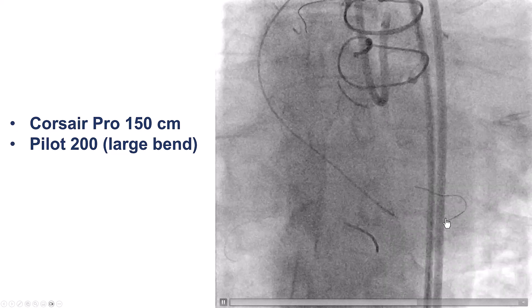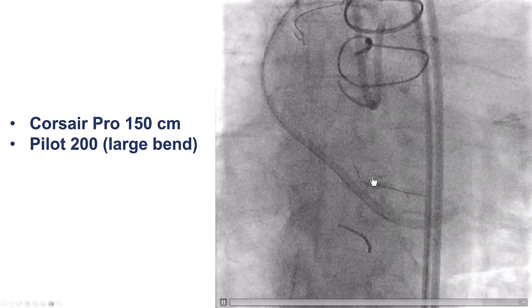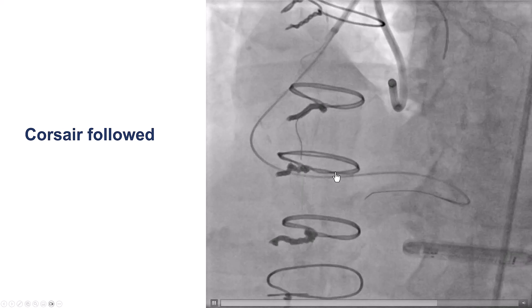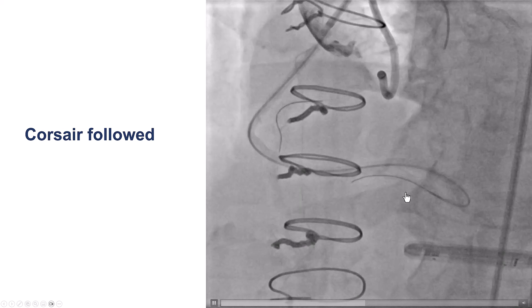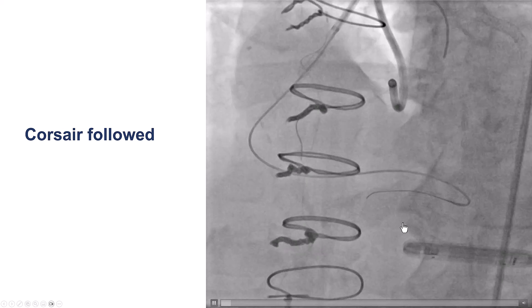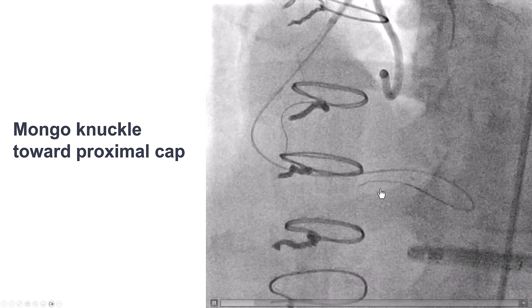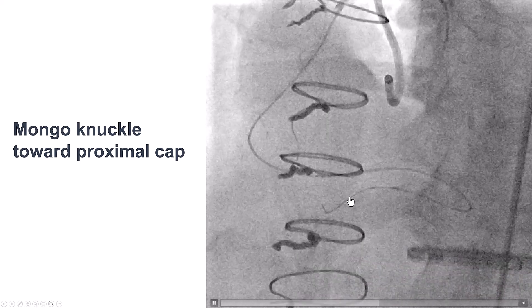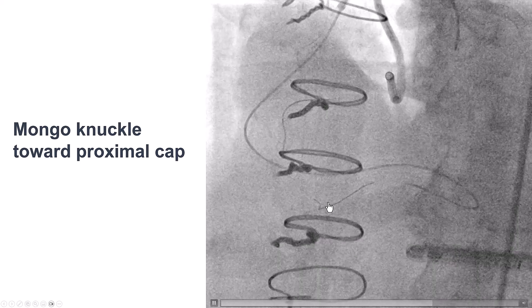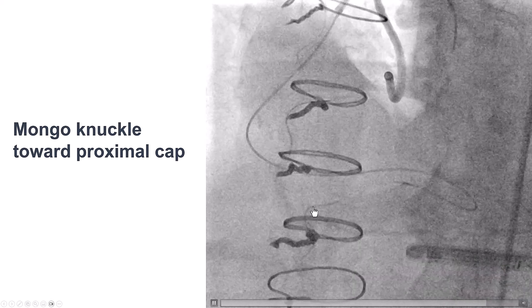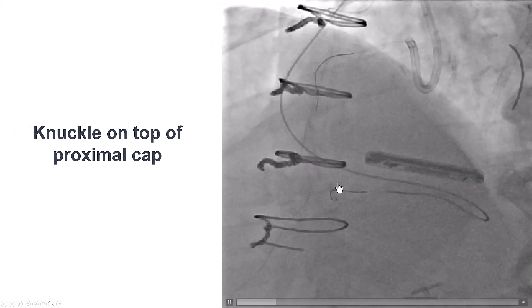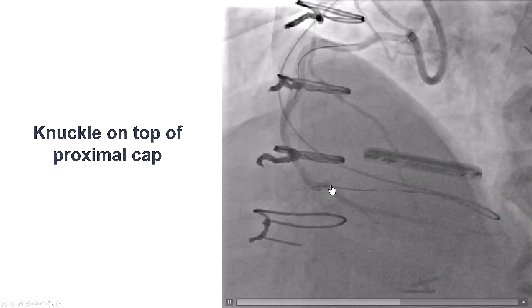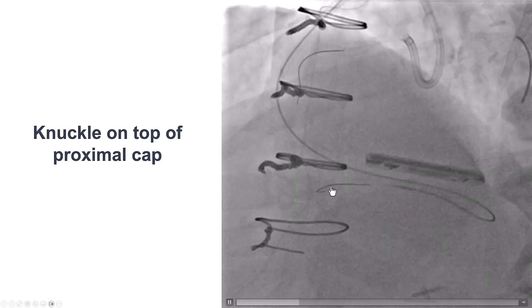The Pilot 200 was very useful for going from the vein graft into the PDA and then eventually into the distal right coronary artery. We were then able to advance the Corsair microcatheter, coming closer to the distal cap. We then used a polymer-jacketed wire — a Gladius Mongo — trying to go towards the proximal cap. The wire seems to be knuckling there, likely hitting the proximal cap. We pushed as the wire knuckled and took the tortuosity of the vessel. With antegrade injection, we see that the knuckle is in the extraplaque location at the proximal cap.